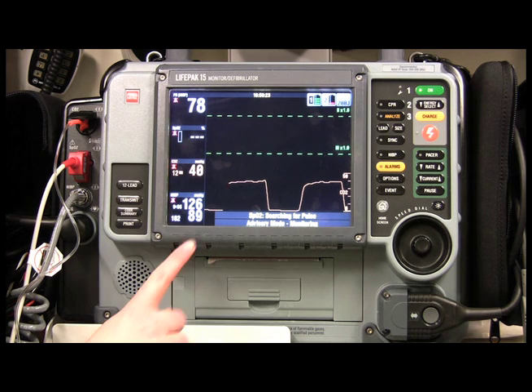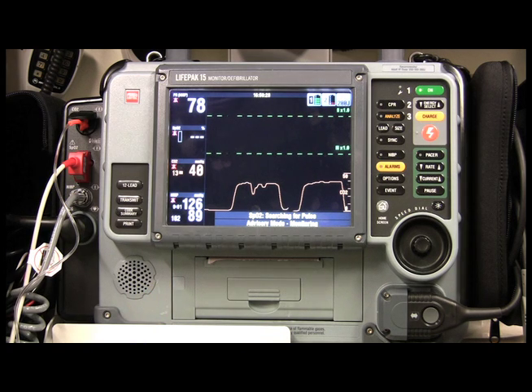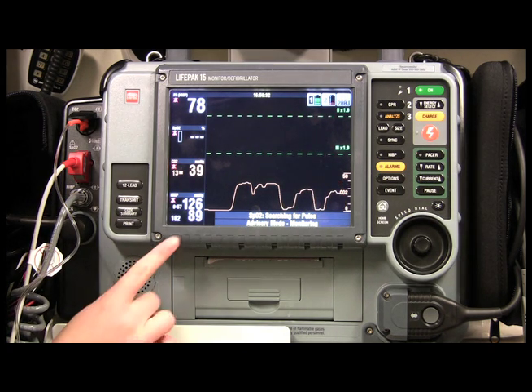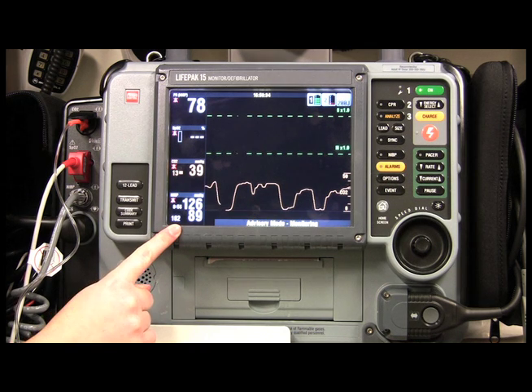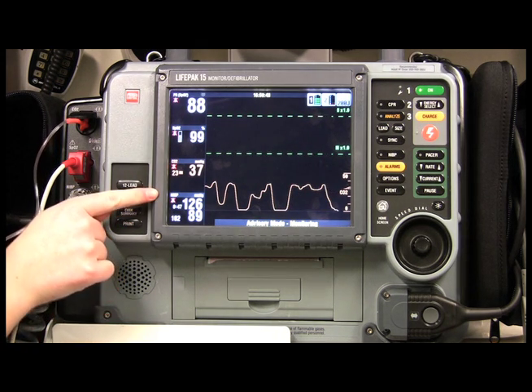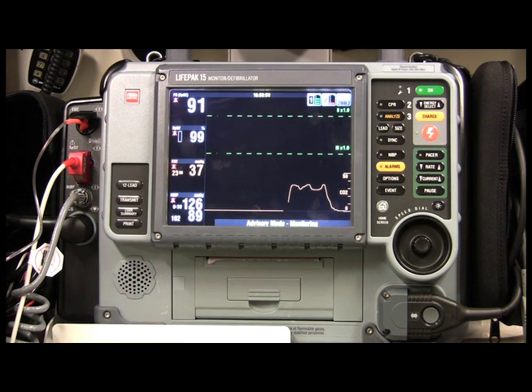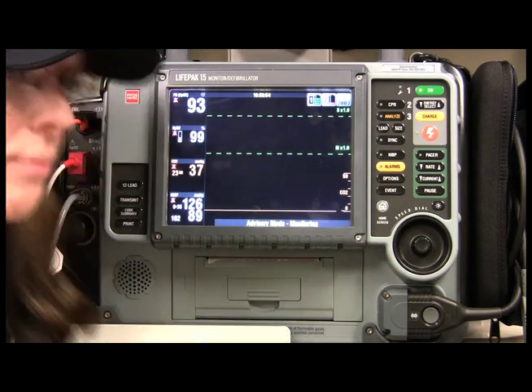We can see a couple of normal-looking waveforms. As you can see, I got the BP reading: 126 over 89. The monitor is set to take a reading every 10 minutes and there's a little countdown timer visible on screen.